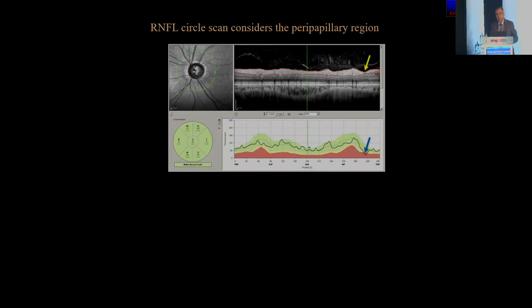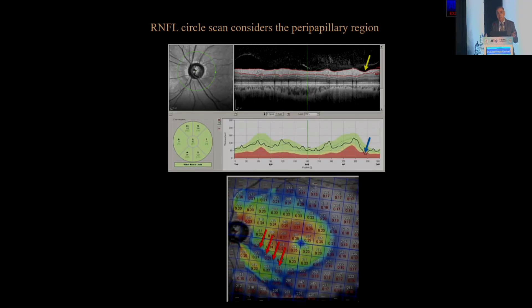The nerve fiber layer circle scan — and the images I'm showing are from the Heidelberg machine, and I have no financial interest with Heidelberg Engineering — shows everything is normal right here. But that's not telling you everything is normal; it's the average of that quadrant that is normal. That's why you have to look at the raw scans and look at the focal loss. It is easy to miss, because naturally we are all going to go to the kindergarten level when we've got hundreds of patients and see where it is green or red. But if you look at the macular thickness of the same eye, you won't miss this loss of tissue corresponding to the nerve fiber layer thickness.